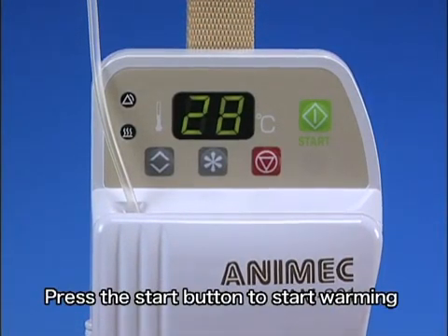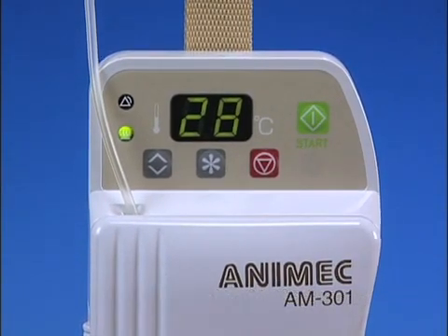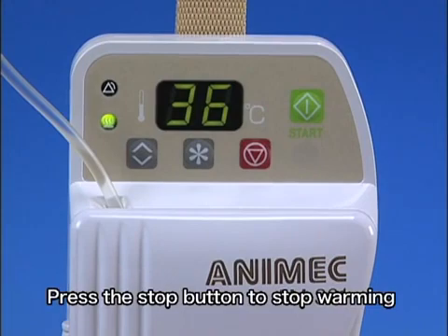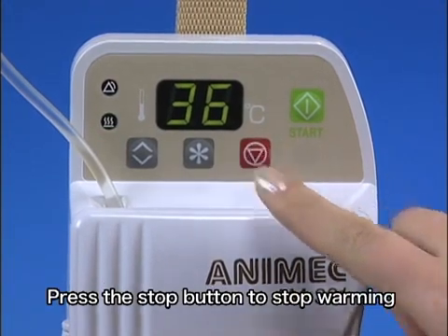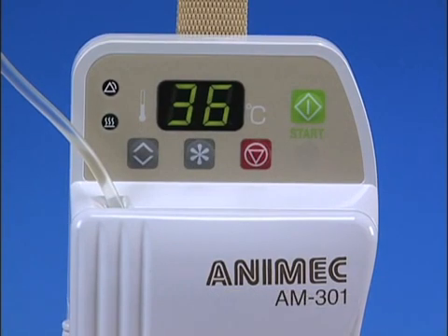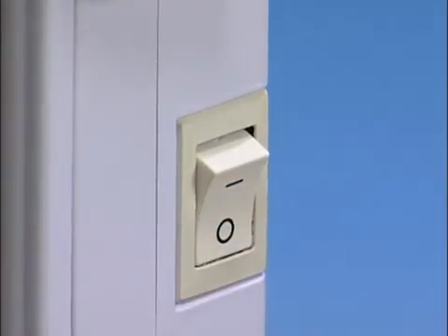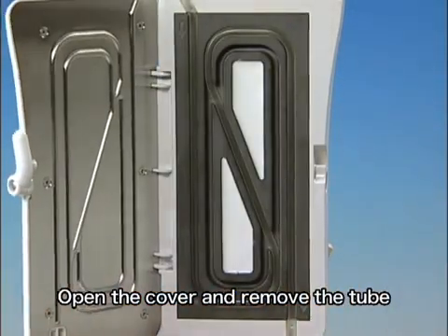Press the start button to start warming. Press the stop button to stop warming. Turn the power off. Open the cover and remove the tube.